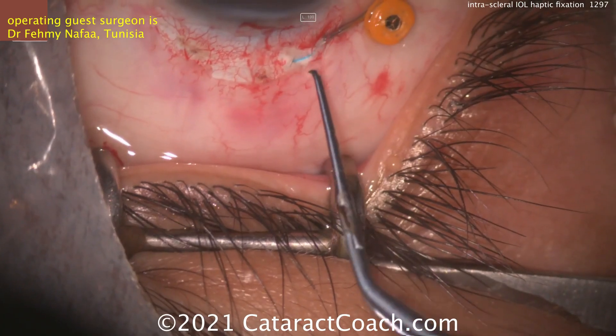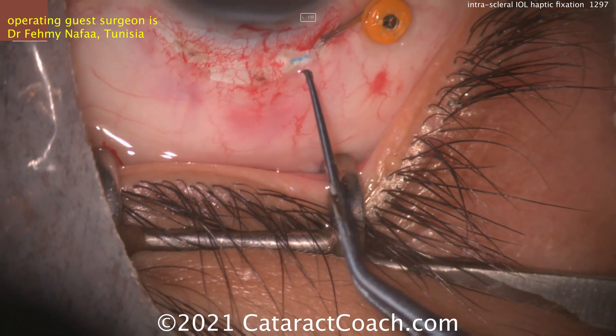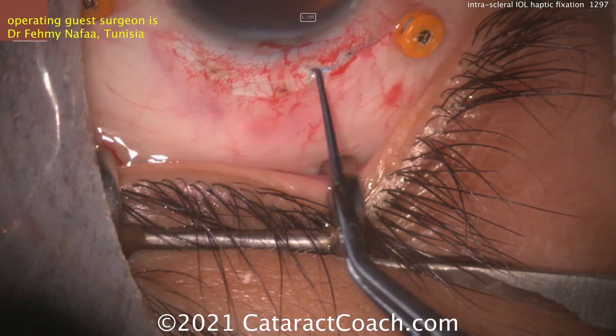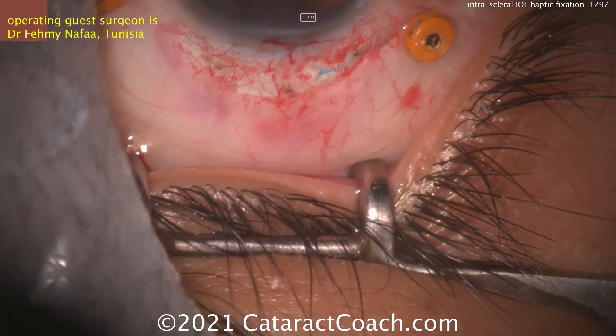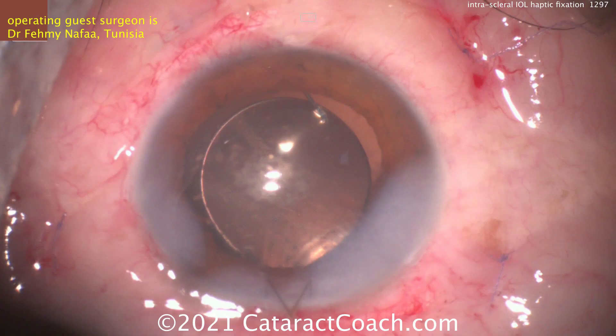Now we're going to advance that haptic — be careful. Some of these haptics, depending on the IOL design, can fracture or break, and that's going to make life a lot more difficult. Certain IOLs may perform better than others — the CT Lucia from Zeiss often is a preferred lens, but any lens can work. And here's the post-op: a beautiful result.